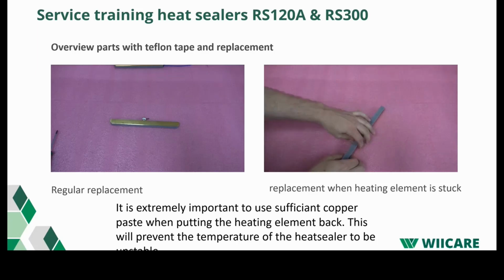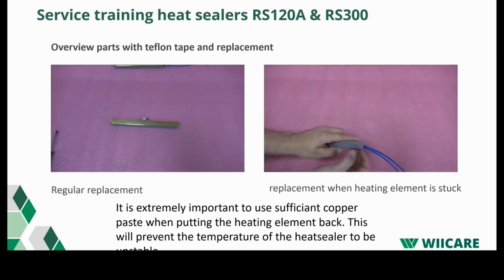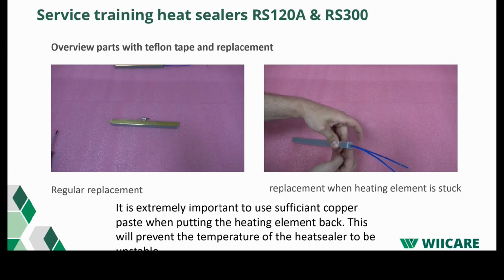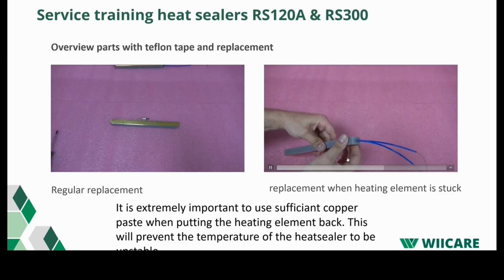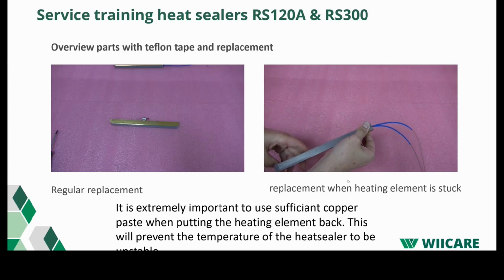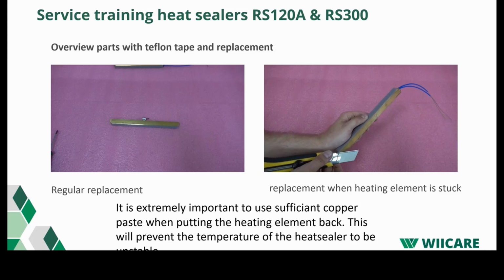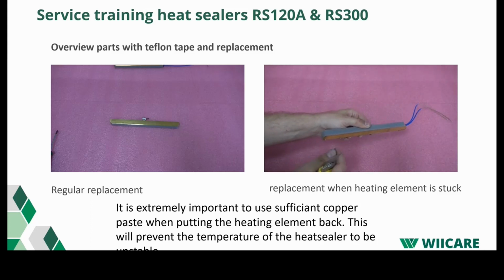Now you need to cut the tape in the middle. And gently fold the tape around the corner. Just make sure that you don't cut it too deep. Cut off any excess. Make sure to use a new knife.